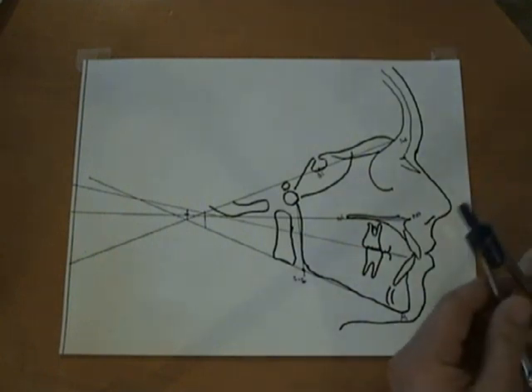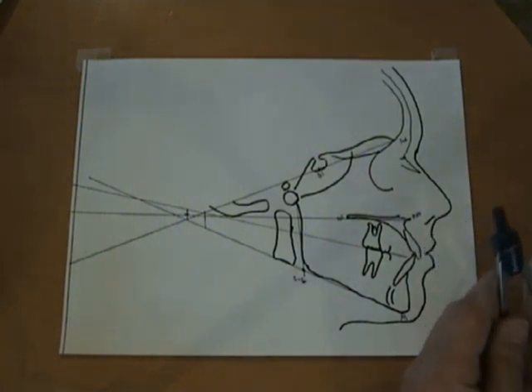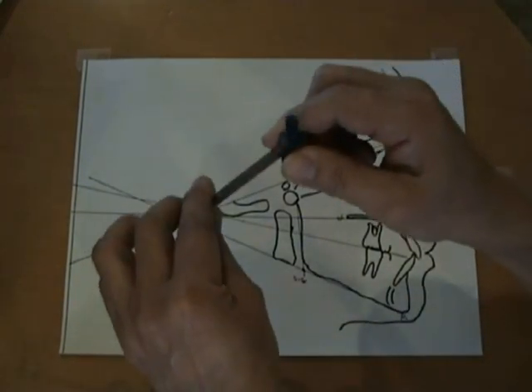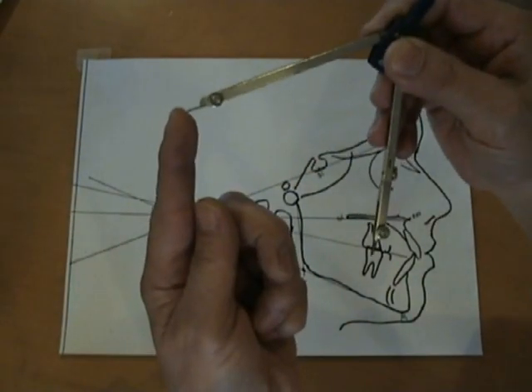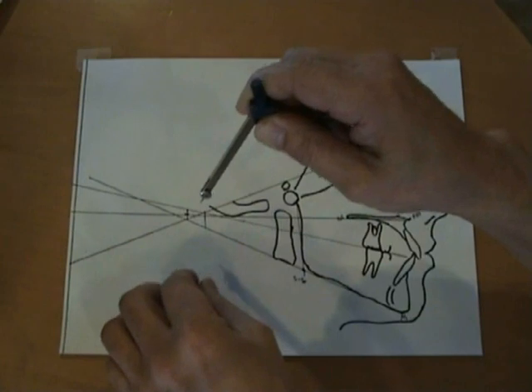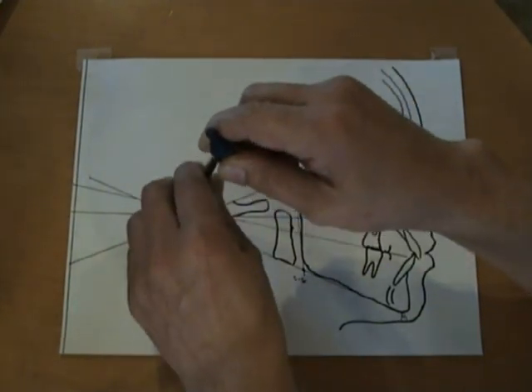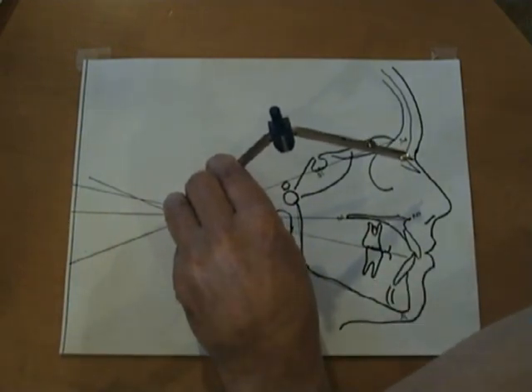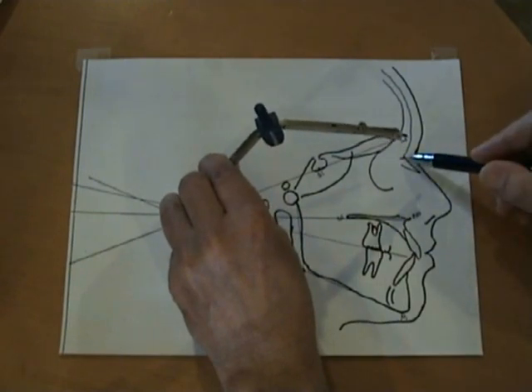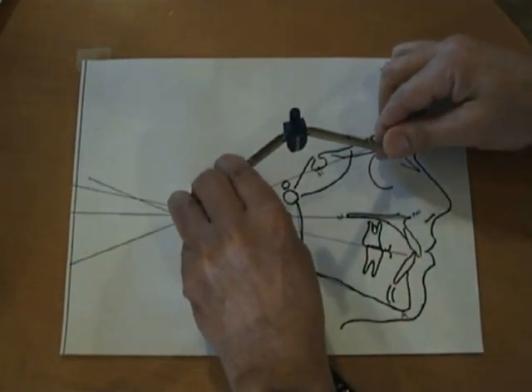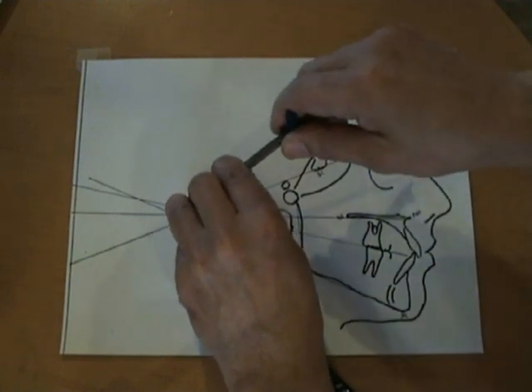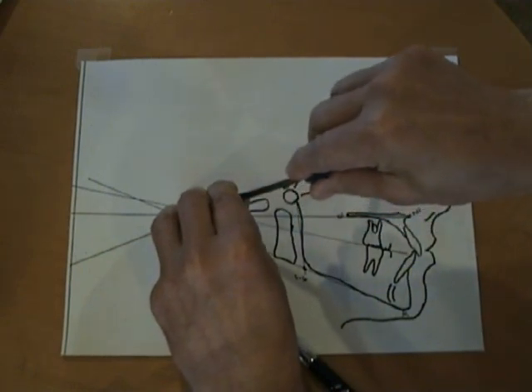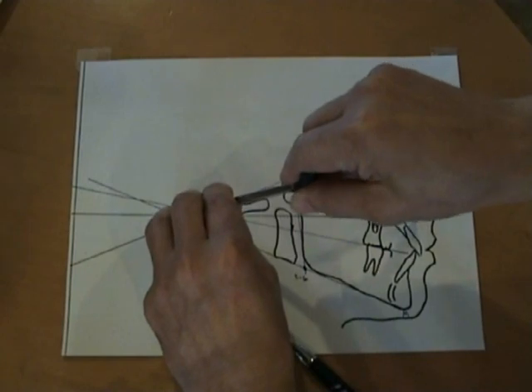To find anterior arc you need to get a compass, and I recommend that you don't get a cheap one. Get one that's a professional grade. This is the metal point. This is the pencil point. Put the metal point on Center O. Put the pencil point on Nazion. Nazion is right here. The pencil point is right there on Nazion, and then strike an arc going through Nazion all the way down past the chin point.